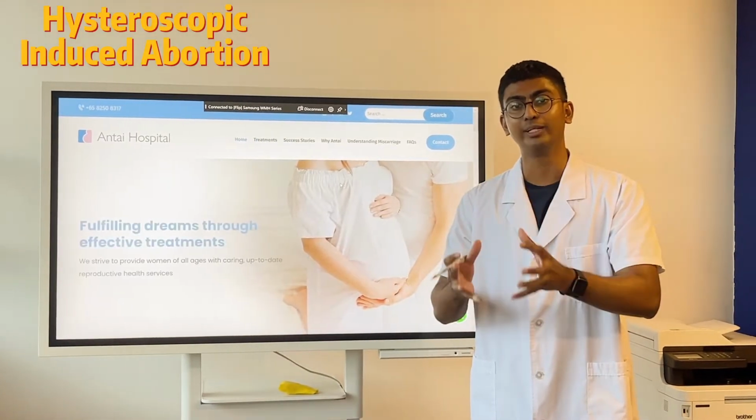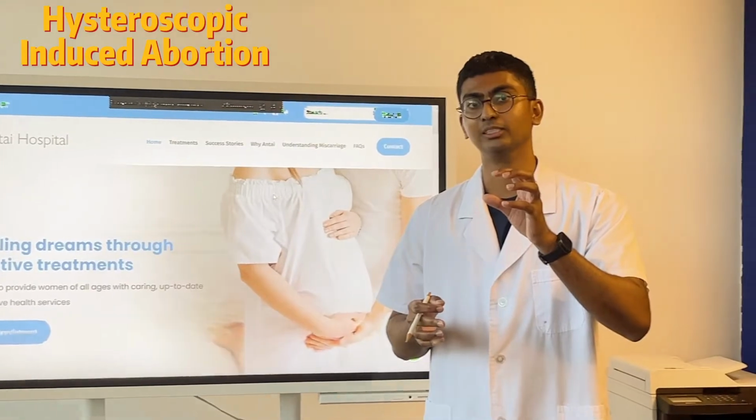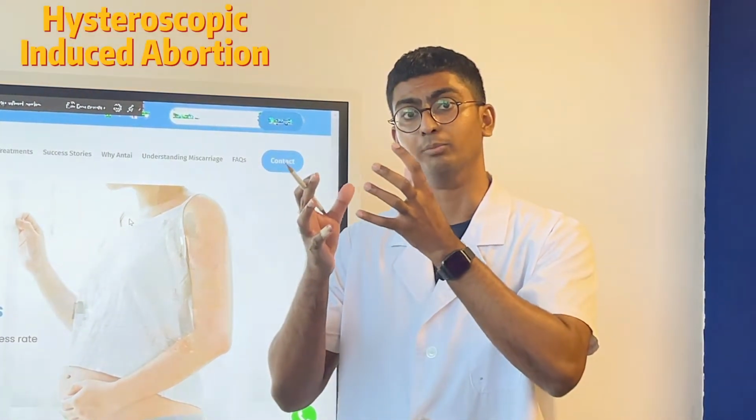Take a look at the video and you can see that when the pregnancy tissue is removed, there is almost no damage done because we can easily spot where the pregnancy tissue is. When there is no damage done, there will be no formation of adhesions, there will be no fetal tissue entering into the mother's system because the entire pregnancy tissue is not shattered. It is completely and wholly removed from the mother's body. And furthermore, because of how preserved the pregnancy tissue is, we can even do further analysis in the lab to figure out what actually caused it. Enjoy the video.